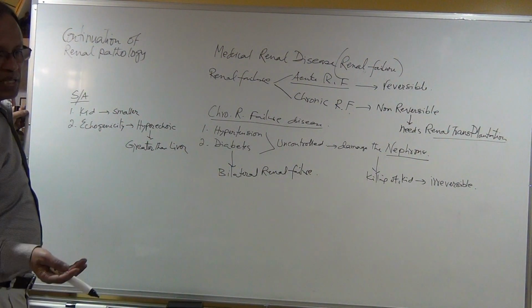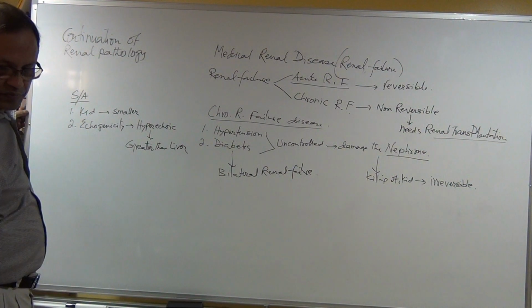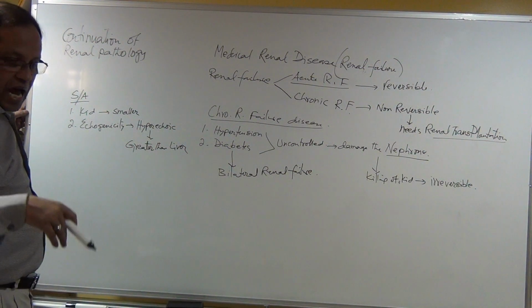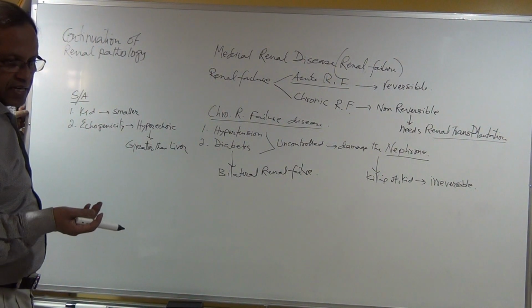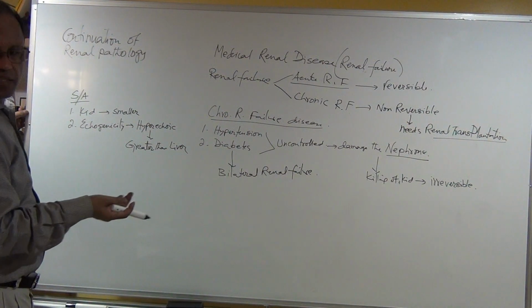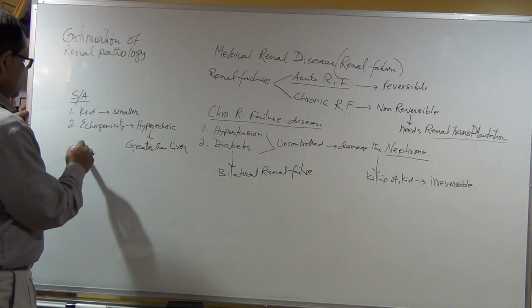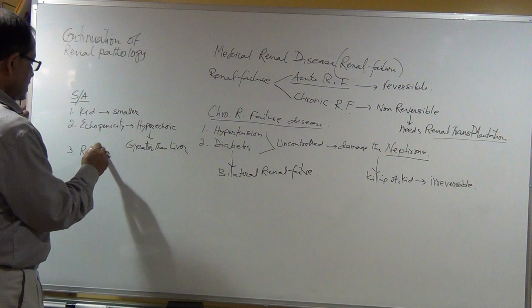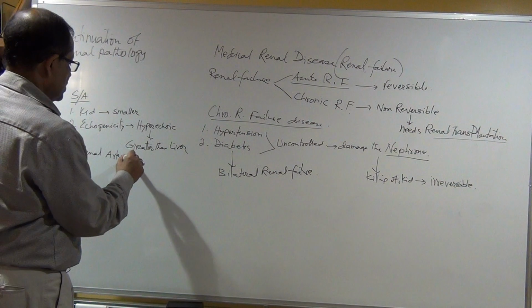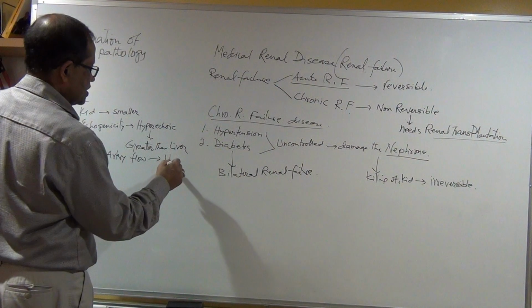The liver is medium level, but you see the kidney is more hyperechoic than the liver. Normally the renal cortex is hypoechoic, darker than the liver. But now you see the renal cortex is brighter than the liver, on both sides. So then do the renal artery flow. Check it out. Then you will see decreased flow.